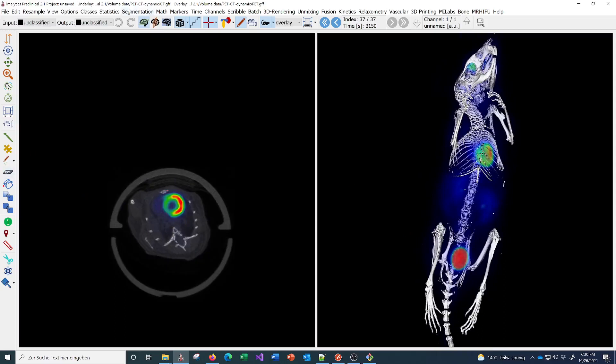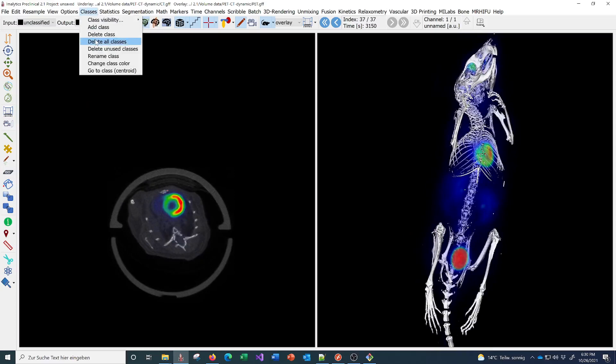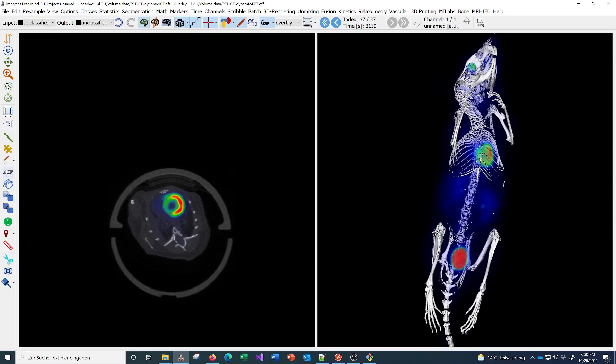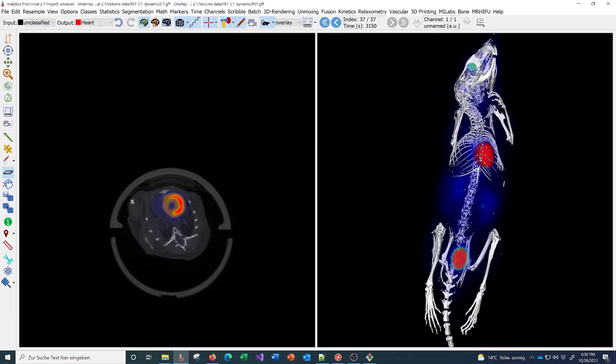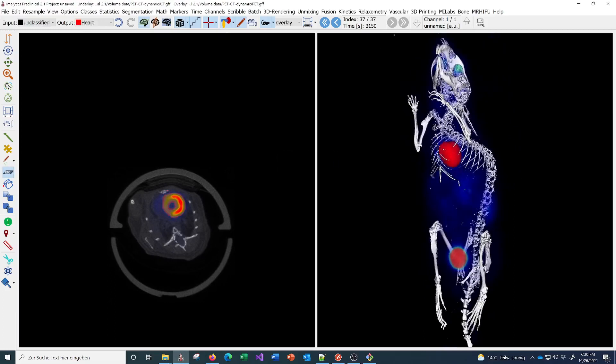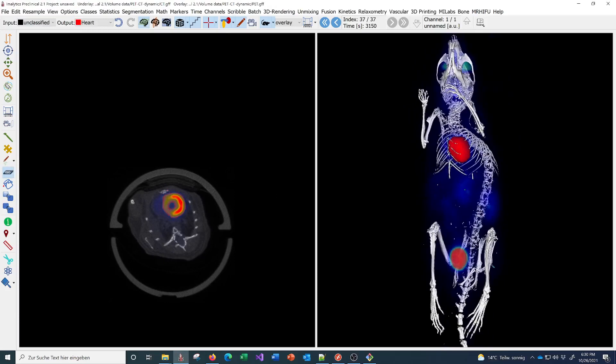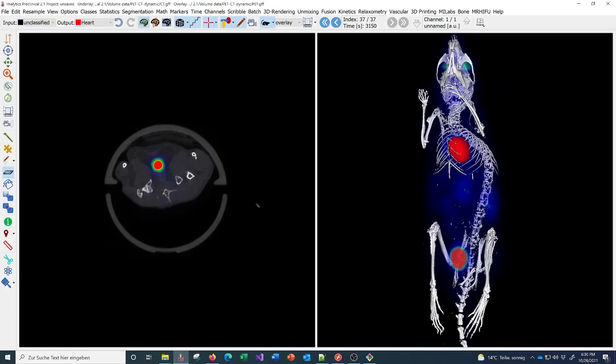I'll just give an example with the ISO tool. You can just click here at the heart and now we have the heart segmented. Or let's go to the bladder here. Now we have the bladder.